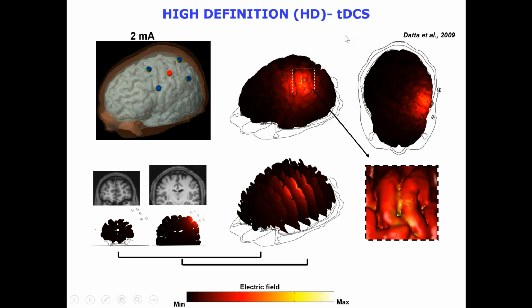We might want to do it at 60 hertz or 90 hertz or 6 hertz between 2 areas in the cortex, maybe here and over here. That would be like a 4x1 design, for example, here, 4x1 design here, and then you're getting this parietal area and some of the frontal area in the executive network, let's say Brodmann area 46, to resonate at the same exact frequency, whether it's 6 or 60, and then we'll test that over the course of 3 rounds.